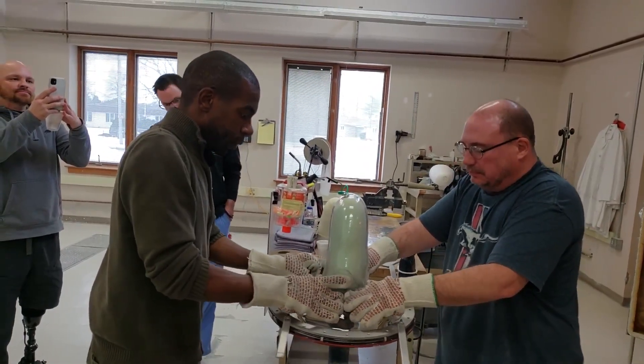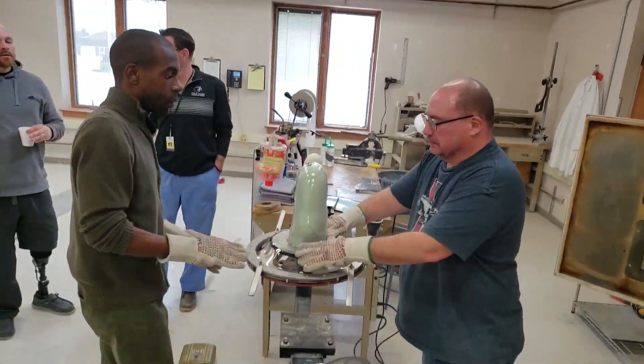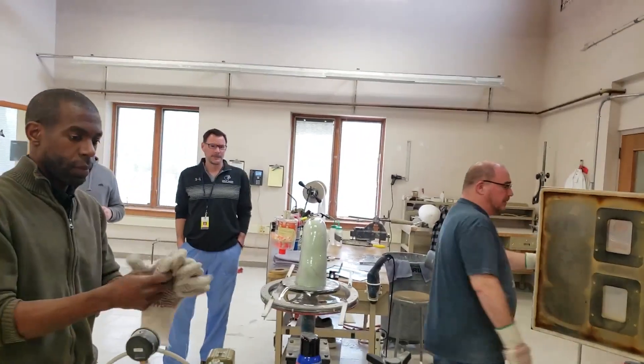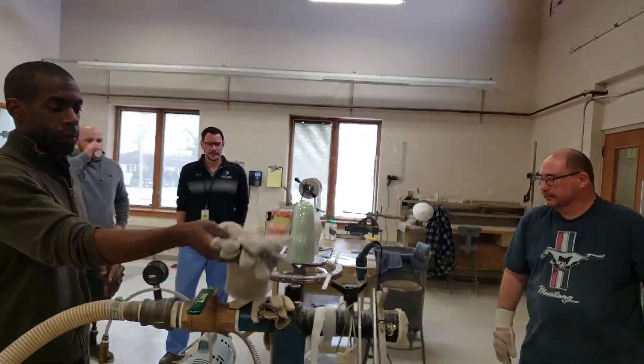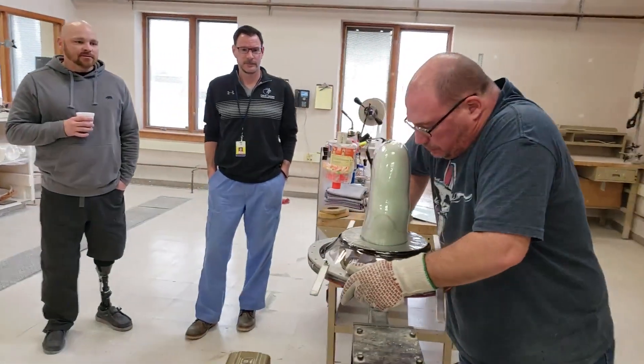Once the plastic is cooled, the technician trims away the excess to expose our initial trim lines, and the socket is ready to be mounted to the additional prosthetic components prior to fitting.